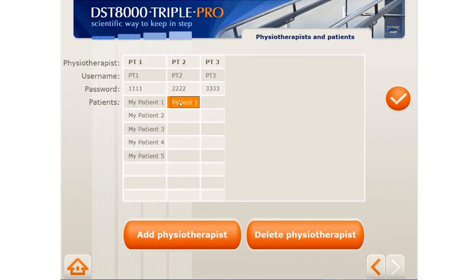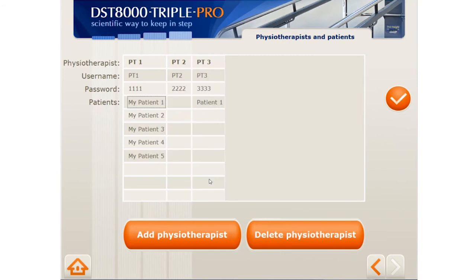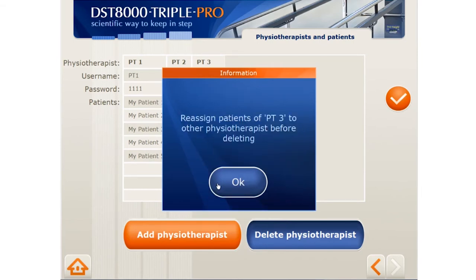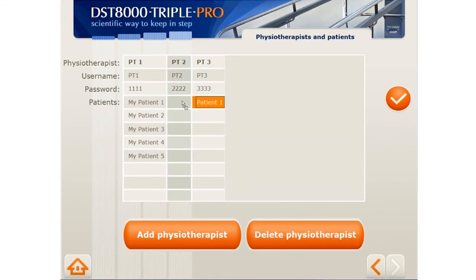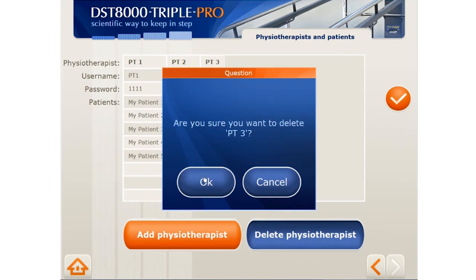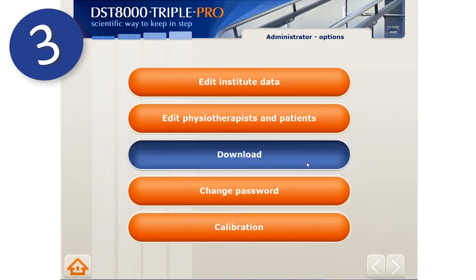You can also move patients from PT to PT by dragging the patient to the designated PT. If you want to delete a PT, simply click here and select the right PT from the list. Please note that if the PT has patients, you will first need to assign them to another PT before deleting them.